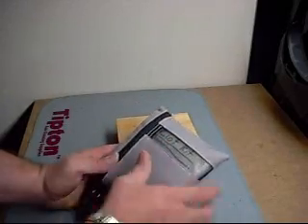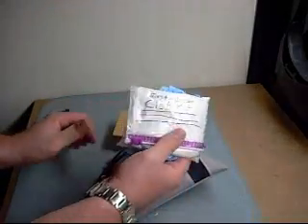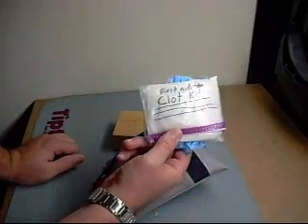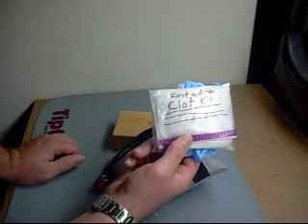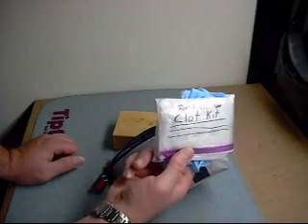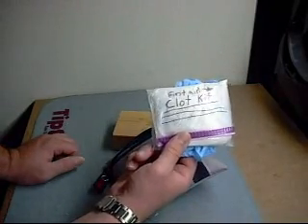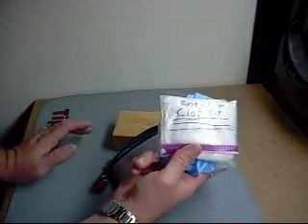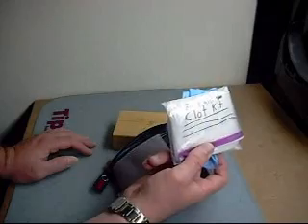Now, something I did here is inside this, you'll see that it's two actual kits, okay? This is a Clot Kit system. Now, you have to understand that this stuff is not sterilized, but it's made so that if somebody's bleeding out, whether it be from a car accident or a little kid fell off his bike and he's bleeding real bad, you can pull over the side of the road, put some gloves on and just stop the bleeding and then dial 911 with your other hand. Whatever the situation may be, if there's other people around, this is just something to protect you, protect them, and to put pressure on the wound.